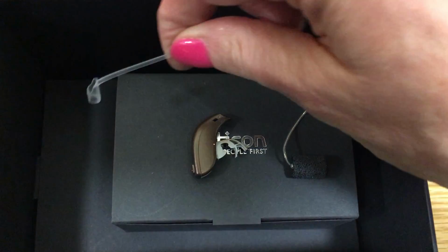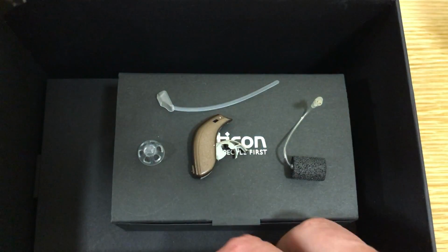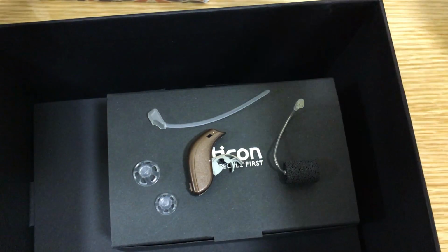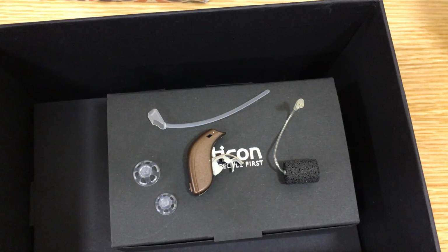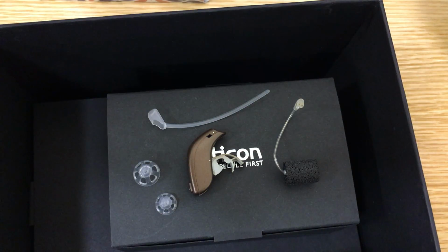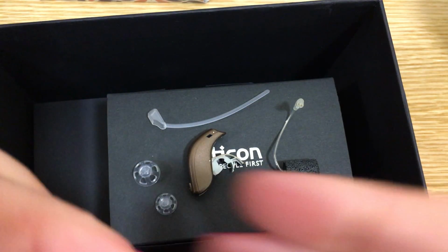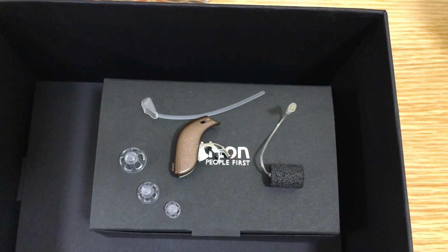a retention tail, a large or 10mm dome, a medium or 8mm dome, and finally a small or 6mm dome. Generally, the instruments are fitted without the retention tail if the dome can hold the receiver or speaker unit comfortably in the ear without slippage.